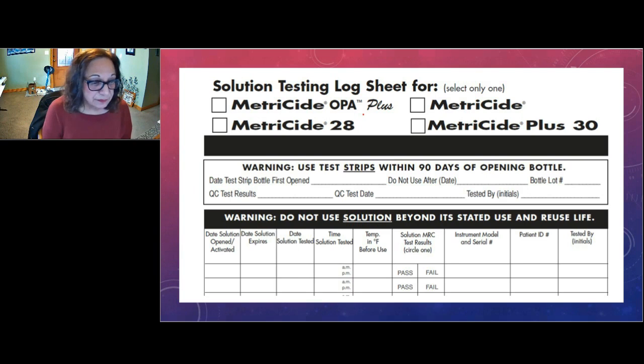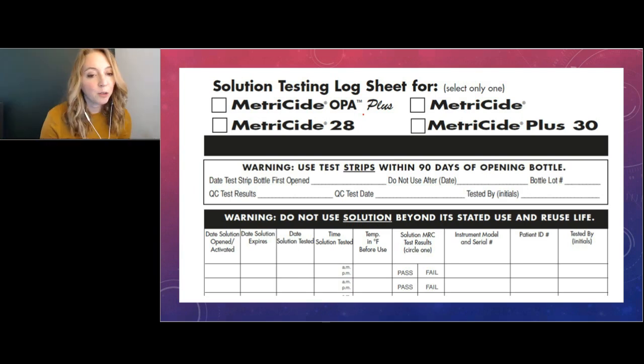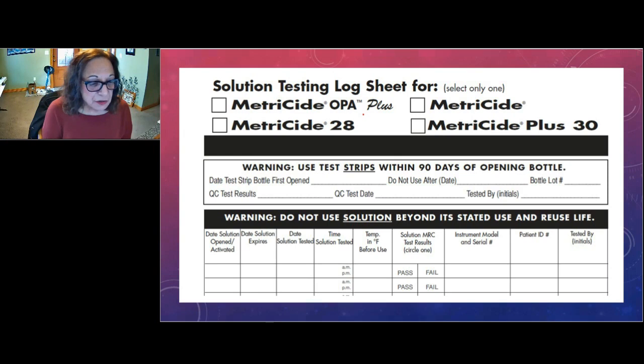Next question. This next question says, should an N95 respirator be worn when working with glutaraldehyde? I have not seen that PPE recommended by any of the glutaraldehyde manufacturers.